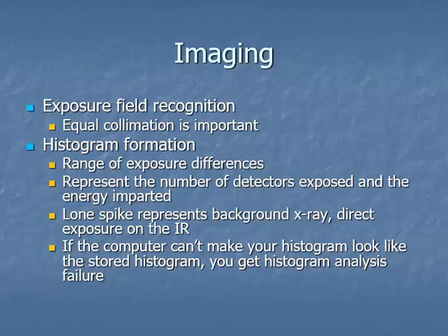So again, if your computer can't really make any kind of sense out of what you did, and it can't match up your histogram closely with the stored histogram or lookup table, then what you get is a histogram analysis failure.